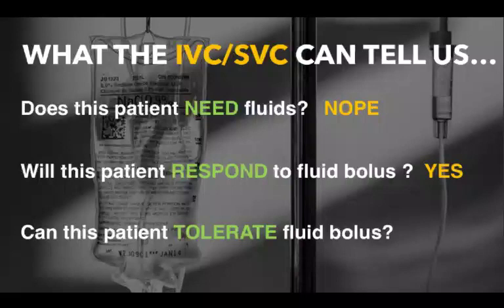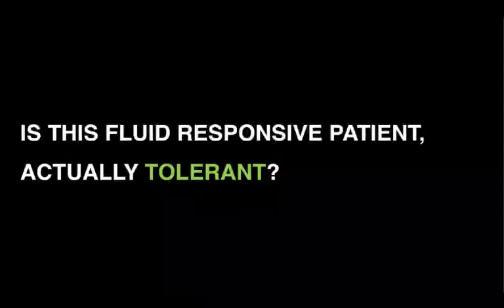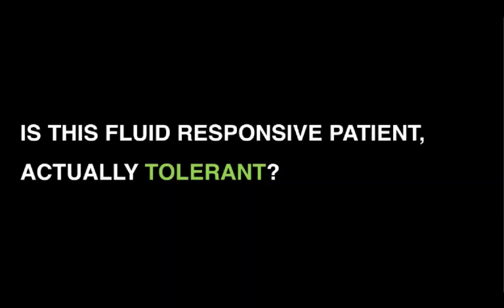Can this patient tolerate the fluid bolus? Yes, but we need to know a couple more things to know at what expense that patient will be able to increase his or her stroke volume with that fluid challenge. So is this fluid-responsive patient actually tolerant? And this is what we're going to try to add a little more information to answer.